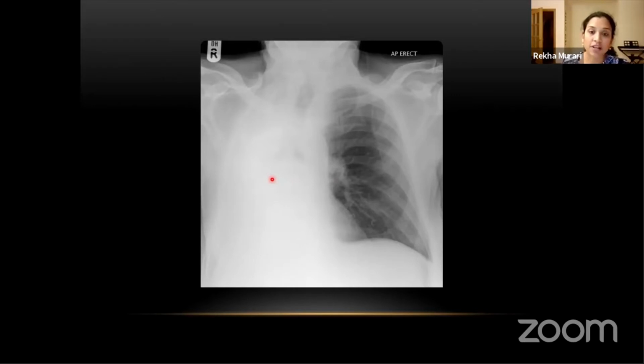But the things to look for in a pneumonectomy: first thing is asking if the patient has had any previous surgery, and then this is a pneumonectomy case. And the second thing is, most of the time you can see missing ribs, especially for pneumonectomy. I think you look for a missing fifth rib, but it can be above or below. So there will be a missing rib.